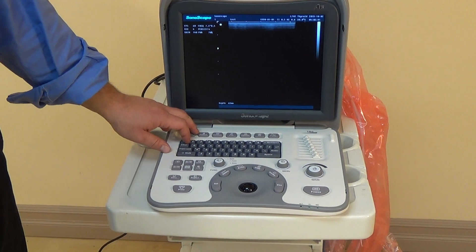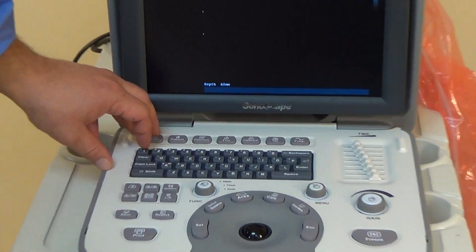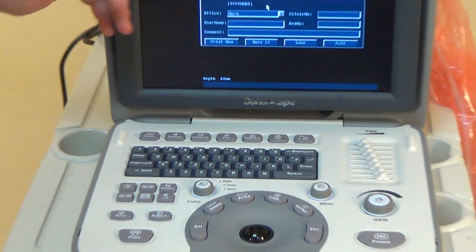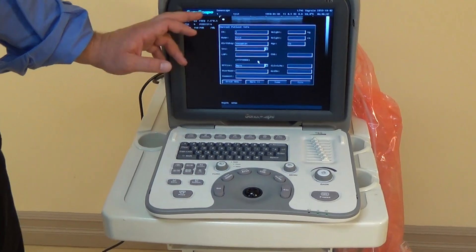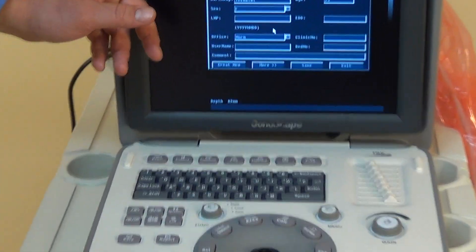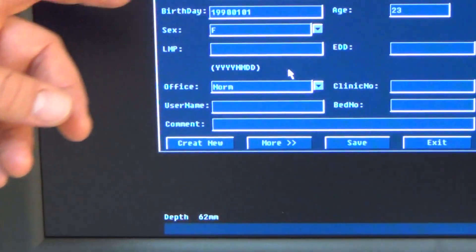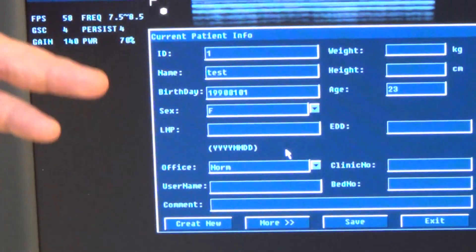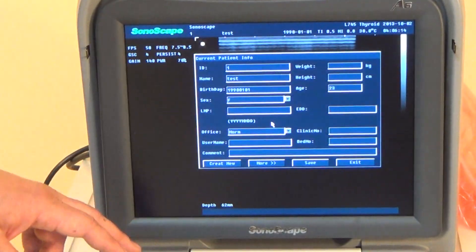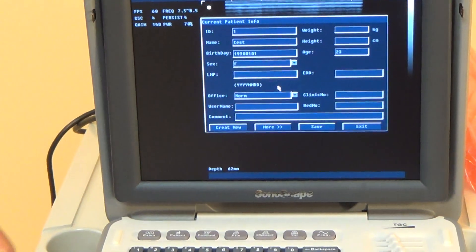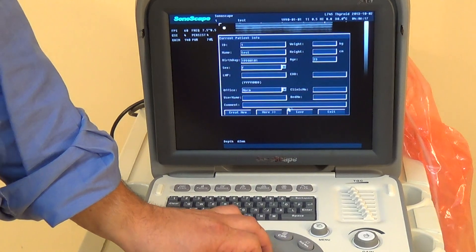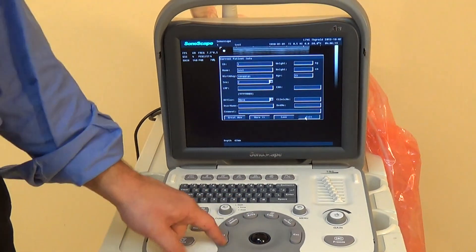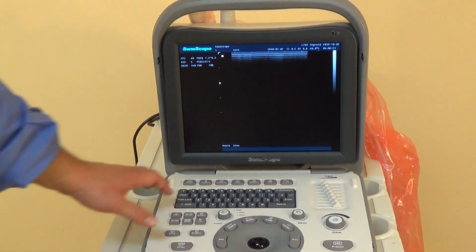The next button we'll be using pretty often is the patient button. Here I just put a test number and a made-up birthday, but you can adjust everything from patient ID, number, height, weight, age, and clinic name — all that kind of stuff. It pretty much depends on how in-depth you want to go.